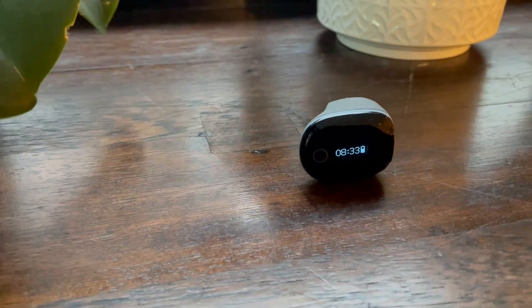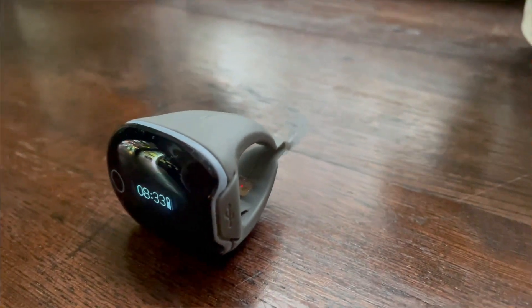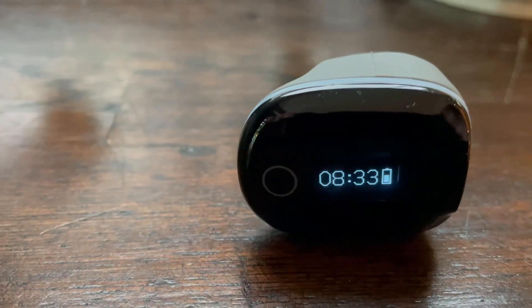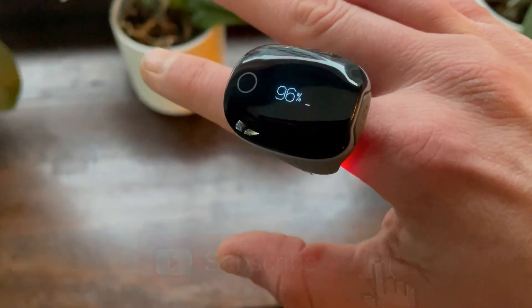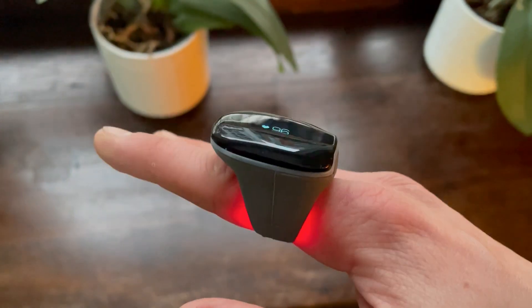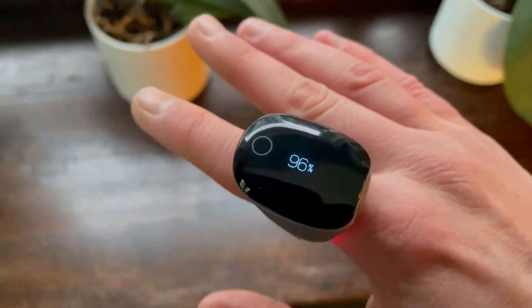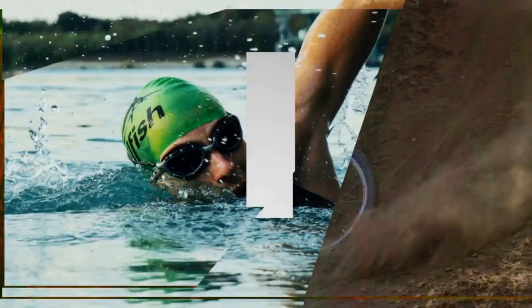Hi everyone, welcome to Wesno's Tech News and Reviews. On this channel we mostly review and test fitness wearables. In order to test continuous SpO2 on smartwatches, we need a particularly accurate and medically certified device. We have that in front of us today: the Wellue O2 Ring wearable sleep monitor. The O2 Ring takes a heart rate and SpO2 reading every one second.